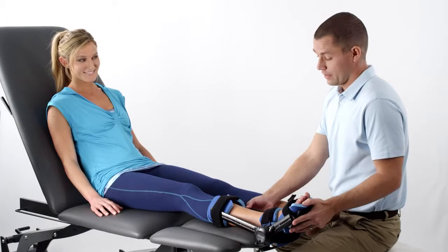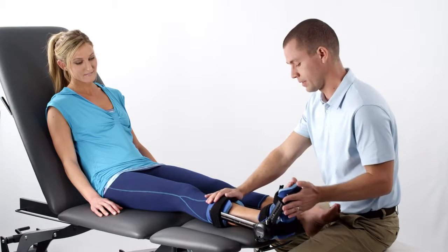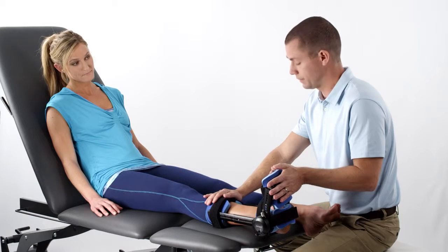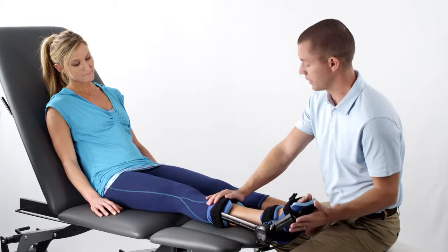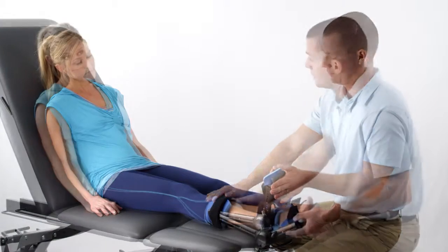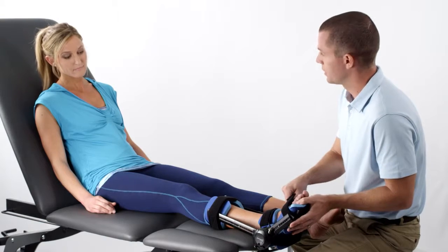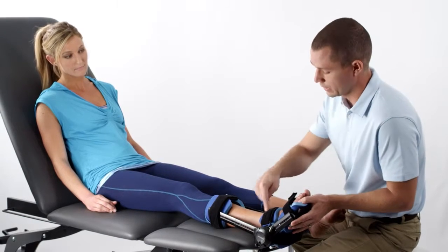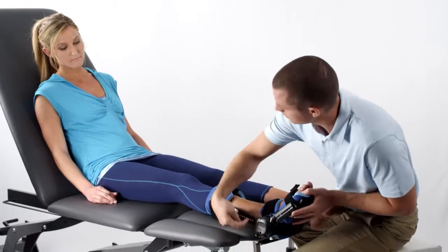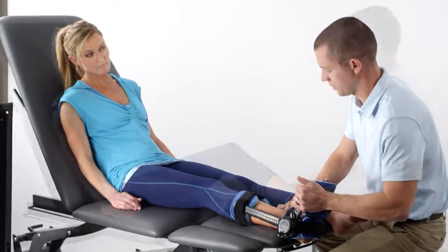When the tension is equal on both tension springs, and when the foot cradle length adjustment is equal on both sides, an even force across the foot plate into dorsiflexion is generated. However, by creating a tension or foot plate length differential, or a combination of both, you're able to create a force into inversion or eversion.